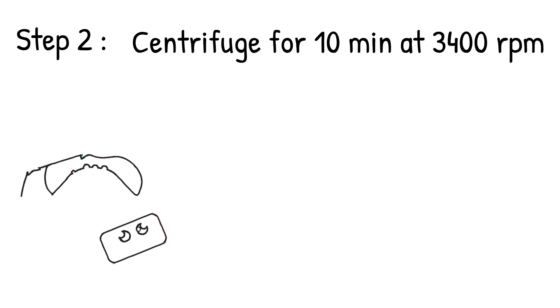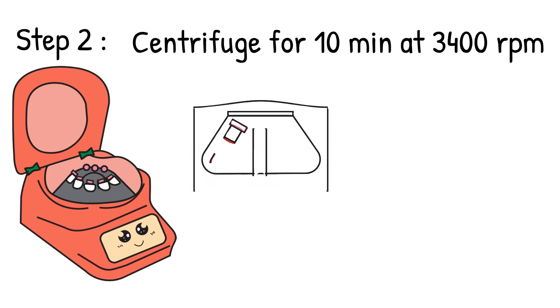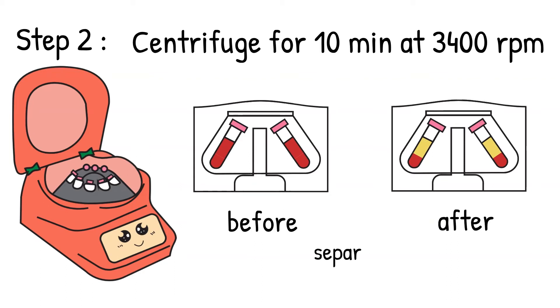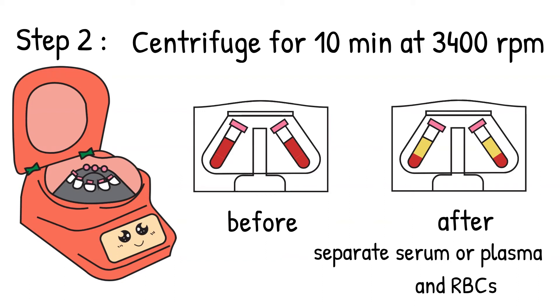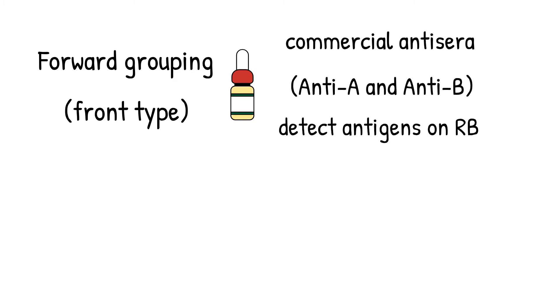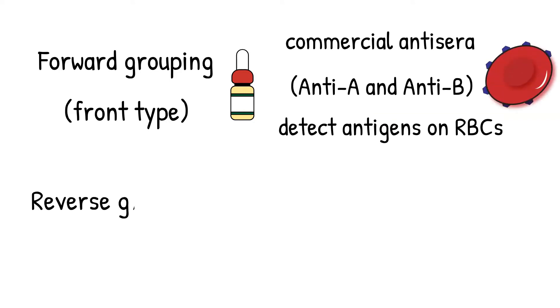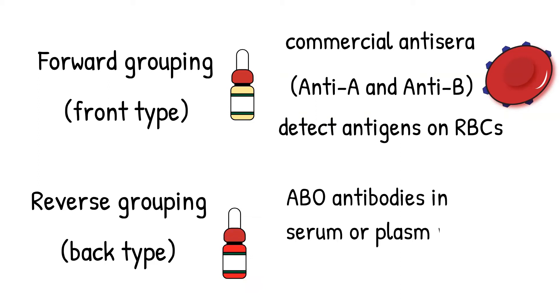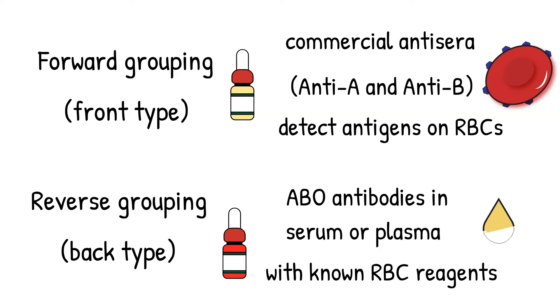Step 2: Centrifuge the sample for about 10 minutes at 3,400 rpm — again, follow your laboratory procedures. This step is to separate the serum and the red blood cells. We have to separate them because ABO typing has two parts: the forward and the reverse type. The forward type uses RBCs, and the reverse uses the serum. Forward typing is defined as using known commercial antiserum to detect antigens on an individual's red blood cells. Reverse grouping is defined as detecting ABO antibodies in the patient's serum by using known red blood cell reagents — A1 cells and B cells.